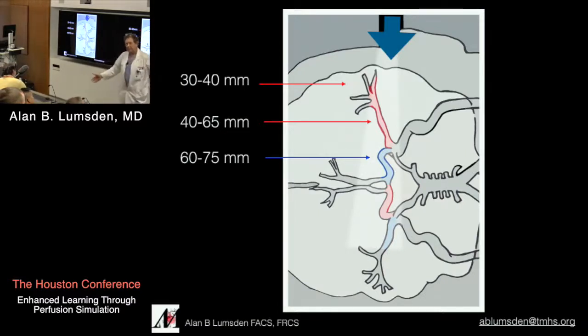Okay, so the value of TCD, to me, this is what we published, was on thoracic endograft. I need to know what is hitting here when you put the guy on pump, when the surgeon puts the cannula in, when the surgeon puts the clamp on. You can't figure this out after the fact. You have to have real-time monitoring and know what is happening up in the head as you're manipulating things down in the aortic arch and the heart, whenever it is.